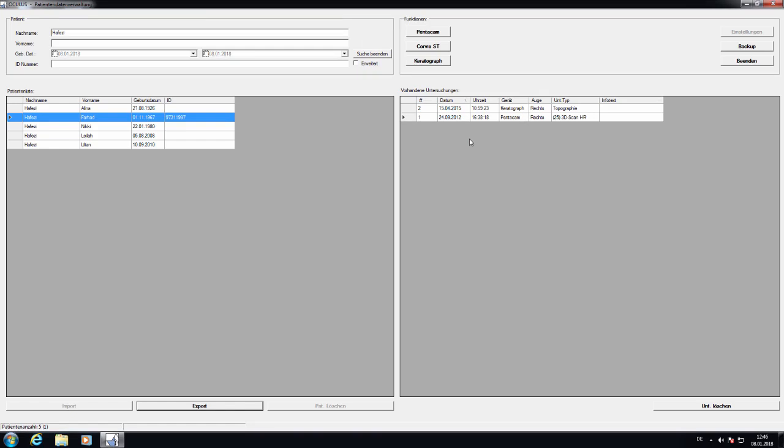Hi, this is Farhal Zafesi and I will show you how to export U12 files from the Pentacam software.